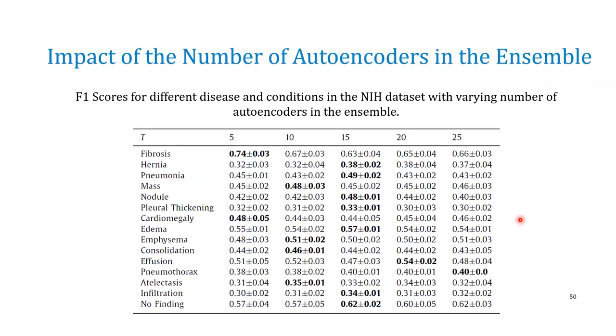Therefore, to conclude about this part of the method, it is seen that for few shot diagnosis, the proposed method can be useful, but it is difficult to find any clear trend about the number of autoencoders in the ensemble, or a clear trend about the superiority of the ensemble or the superiority of the use of the weights across all the diseases and conditions. At least for some, or let's say most of the diseases and conditions, the proposed method is better than others, but not for all of them.